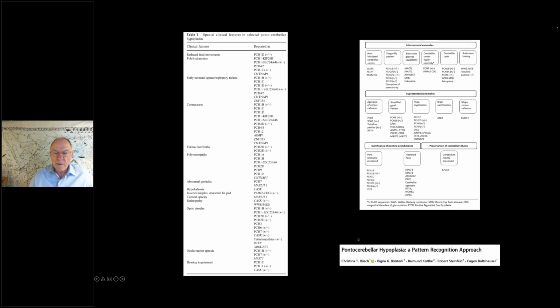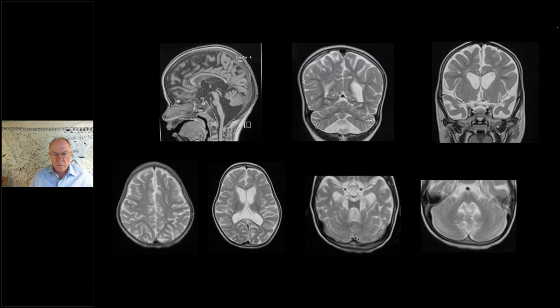This is a review paper authored by Aigen, but I think, at least on the imaging, I can say that this is a neurodegenerative disorder with a pontocerebellar hypoplasia pattern and possible genetic diagnosis. At this moment, I'll open the case for further comments.